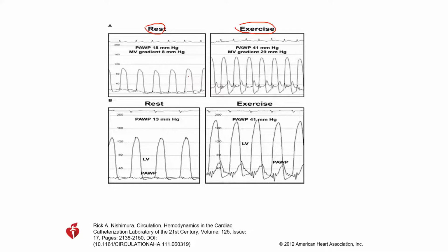So, remind you, this is invasive hemodynamics. So how could we do exercise during the cath lab? While we are doing invasive hemodynamics, how are we going to exercise the patient? Any idea? It is by bicycle ergometer. You know, the patient is on the bed and there is a bike at his feet. So he's exercising there without messing up the upper part, which we are working on. So that's the setup. The setup is a bicycle ergometer, okay?